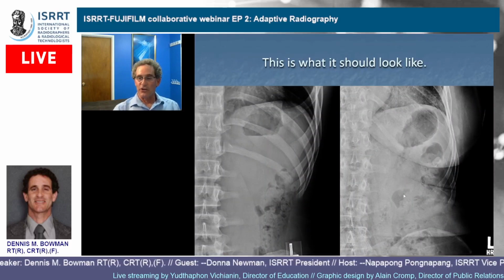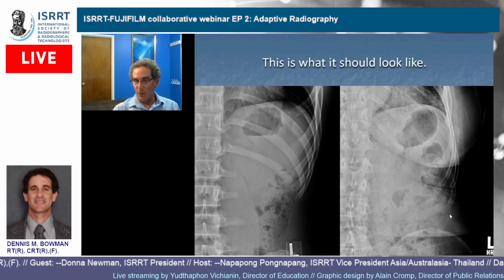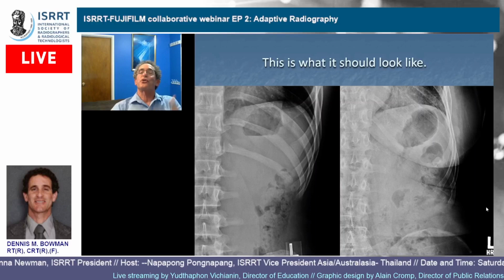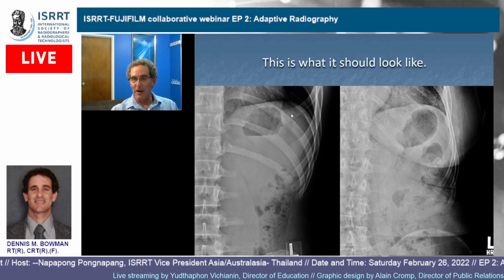But these are the perfect shots, right? Here's the one where there's almost no crest. Here's a full inch, inch plus of crest. And this one didn't need it because they weren't right on it. And this one wasn't on either. So both of these patients are sort of long-waisted, let's say. But again, we're getting diaphragm with a little above, diaphragm with a little above. So that's the perfect shot for both of them.